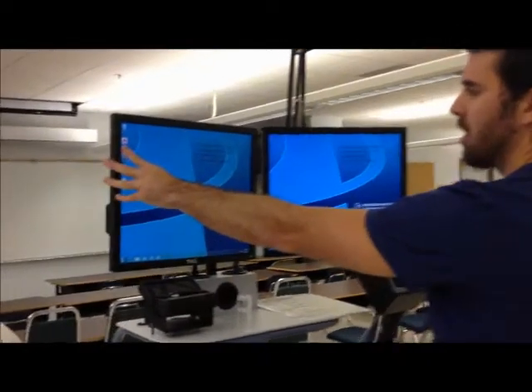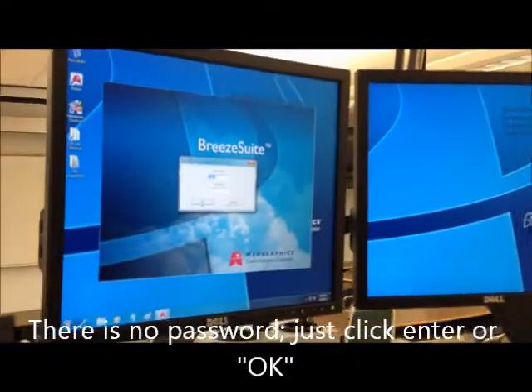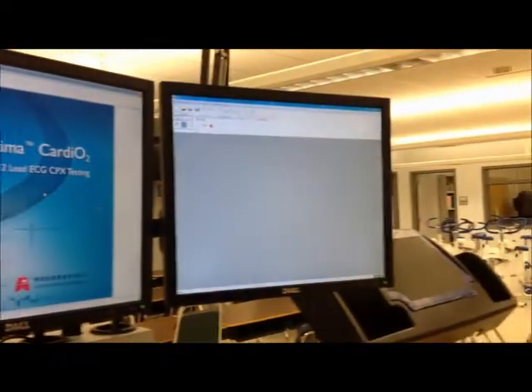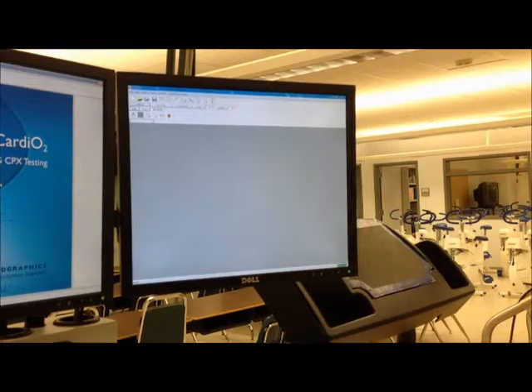To calibrate, go to the Breeze software on the computer. This is the software for testing on this computer in the system. There's no password, so just click OK. You will see a dual monitor setup — this monitor is for the EKG, and this one is for metabolic data.